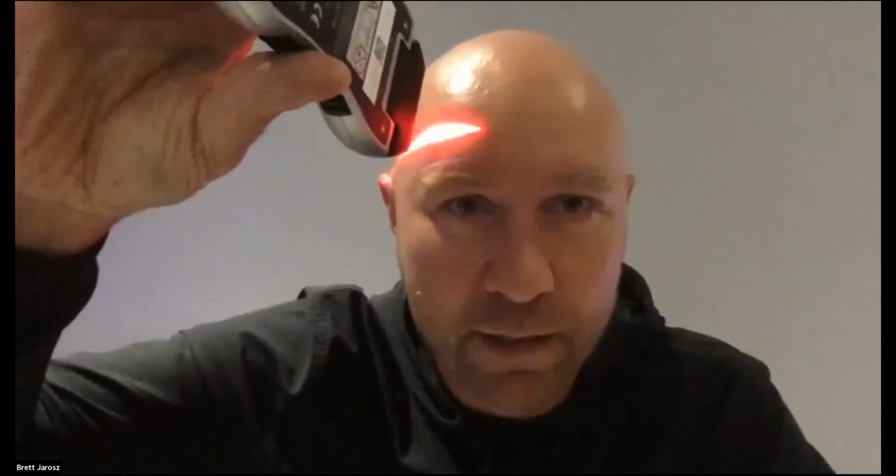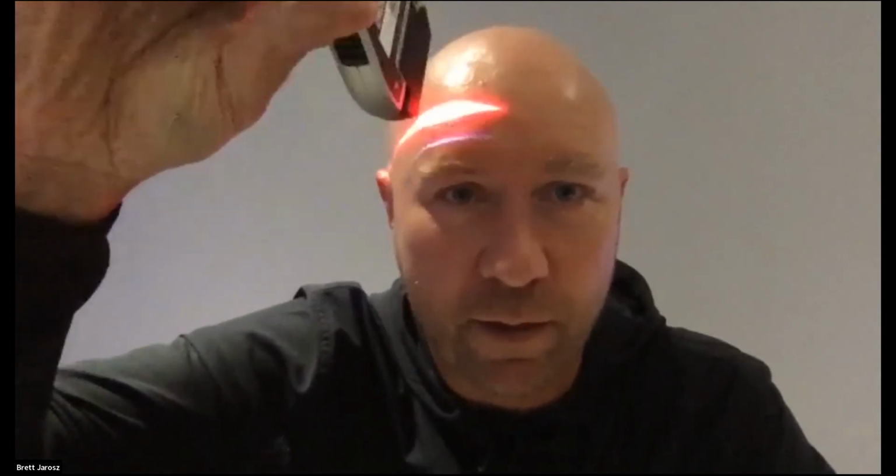So then I'm going to come in, and again, got to get myself orientated, and then I'm going to be lasering that parietal cortex for that area, okay? And I'm going to laser that for 2 minutes. And again, trying to be perpendicular, about 10 centimeters away for the purpose of video. A little bit tricky, but that's what I'm trying to do when I'm doing it in real life. And then the last bit here is 2 minutes prefrontal, okay, working on that prefrontal cortex on that side.